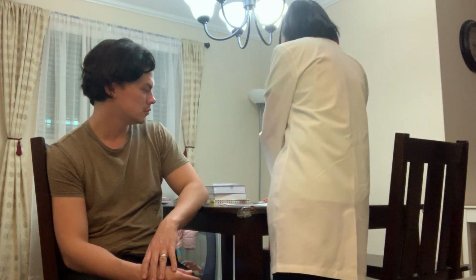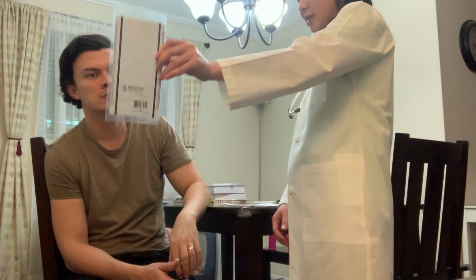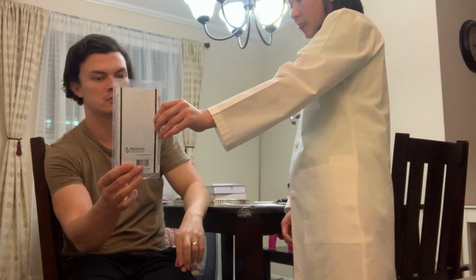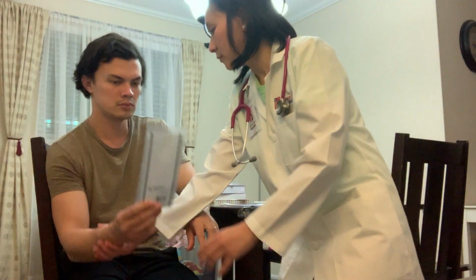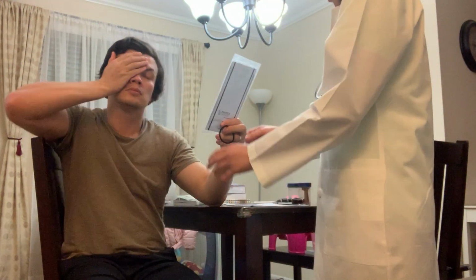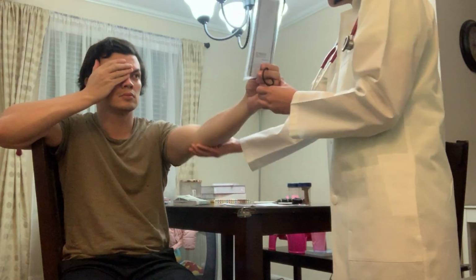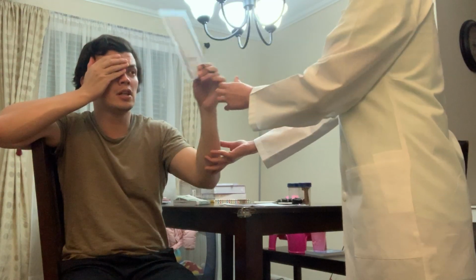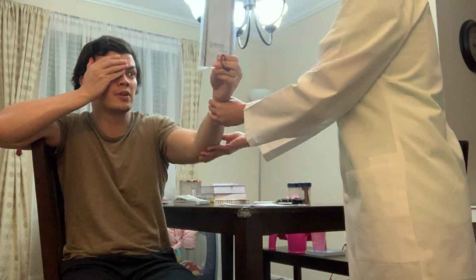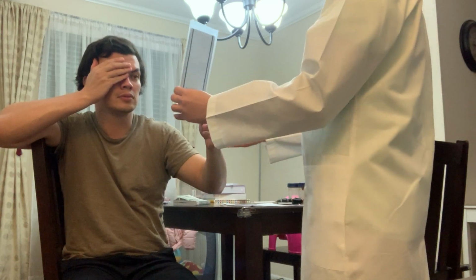And then after that we're going to be checking for visual acuity. So usually we would use a Snellen chart. Right now we just have the portable one. So I would ask the patient to hold it at arm's length. Can you please hold it up? And then cover one eye. Can you read the smallest letter? Arm's length? No, this is how I read it. I can't read it if it's that far. LTFPH. And then the other eye?